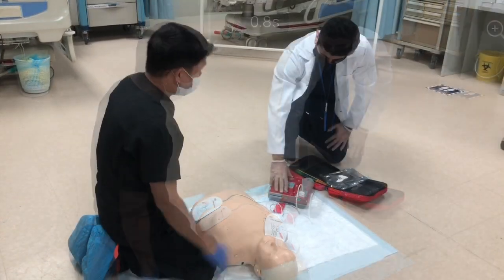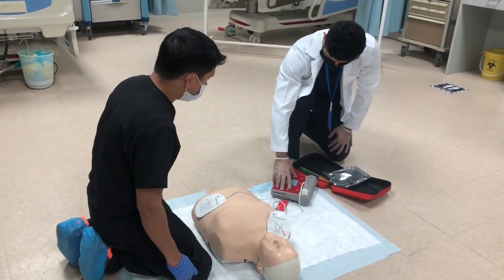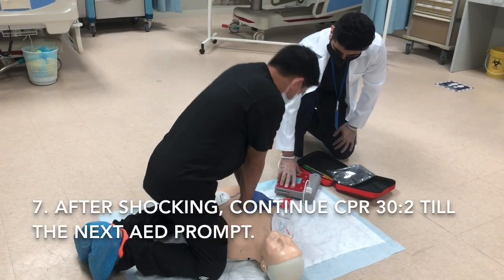Stay clear of patient. Analyzing heart rhythm. Shock advised. I'm clear, everybody clear. Shot delivered. There's your shot.